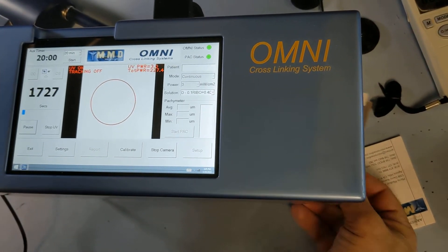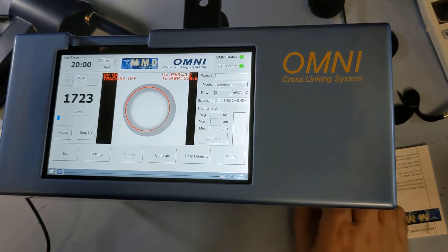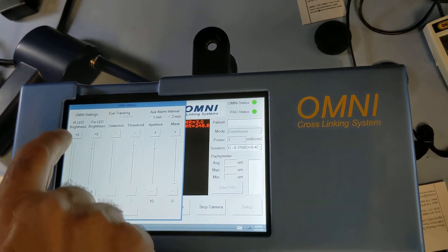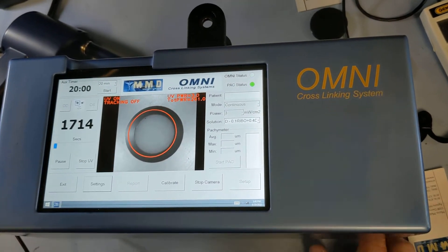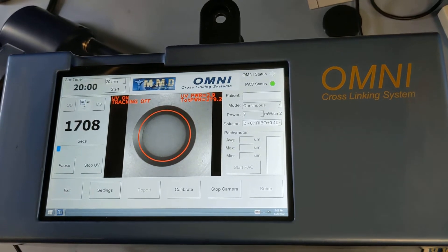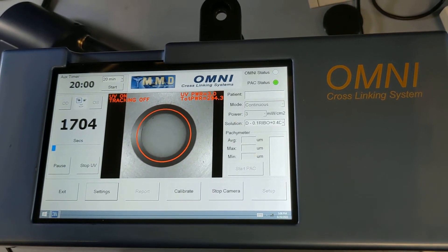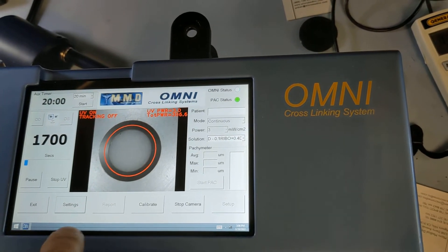The IR settings are important. If the IR is too low, the camera may not see the eye. You can bring up the IR level — it won't affect the patient's vision since you can't see IR. So just bring up the IR level if you're having tracking problems.